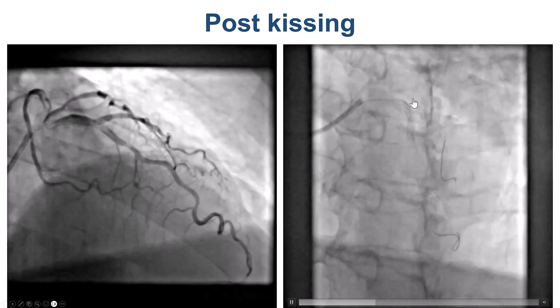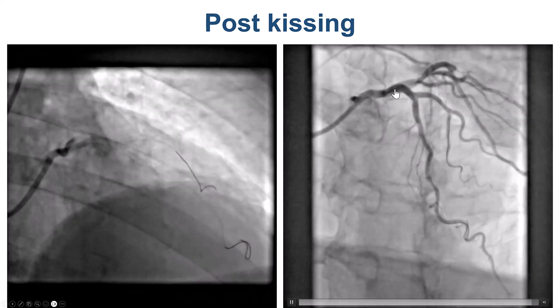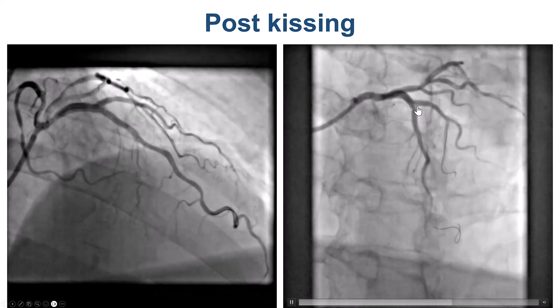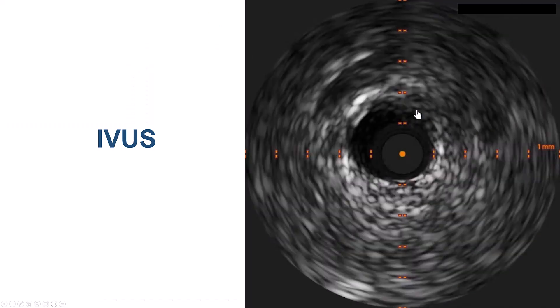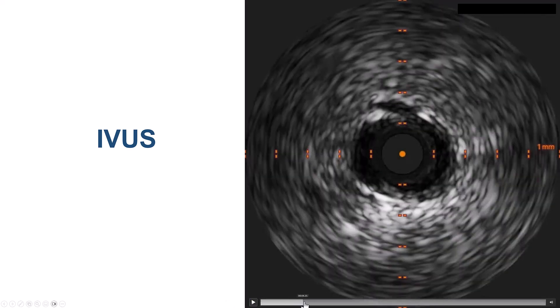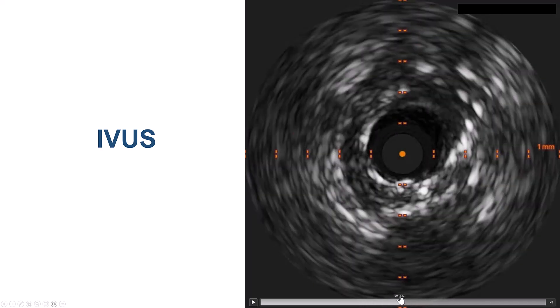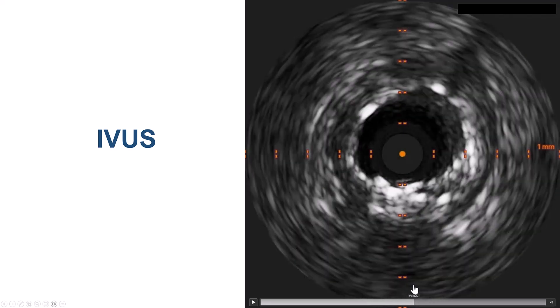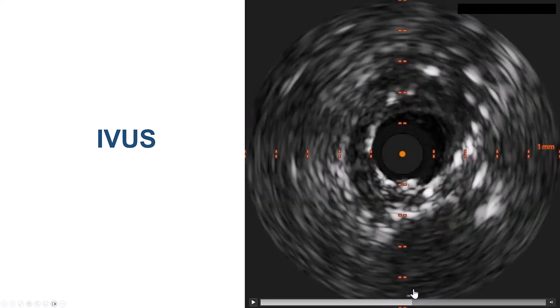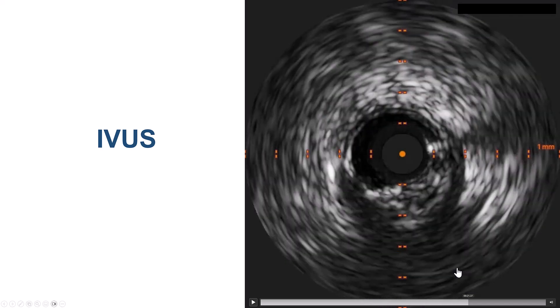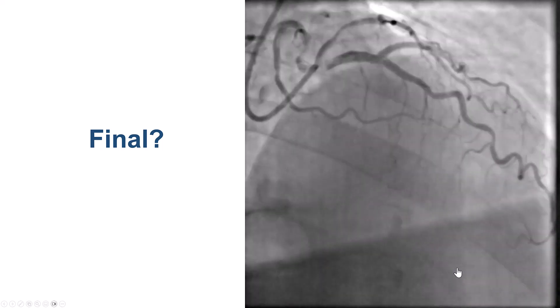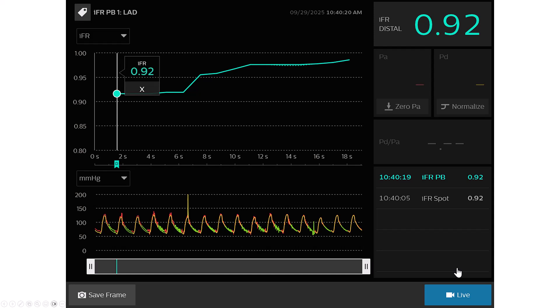We can see the crushed stent in the LAD, crushed by the subsequently placed diagonal stent. To check on this, we performed intravascular ultrasound coming back from the LAD, and found good expansion distally. As we came closer to the diagonal we also had a decent result without any significant under-expansion of the LAD stent. To be further sure, we placed a pressure wire — the FFR was 0.92, with some step-up that was mainly proximal to the stent — so we decided not to do any further PCI.